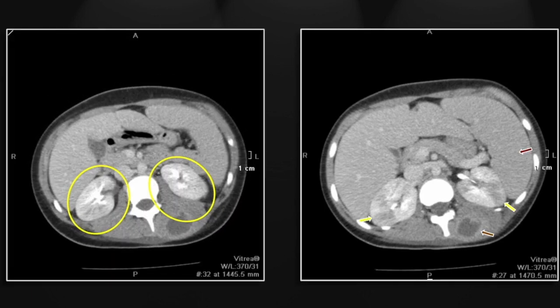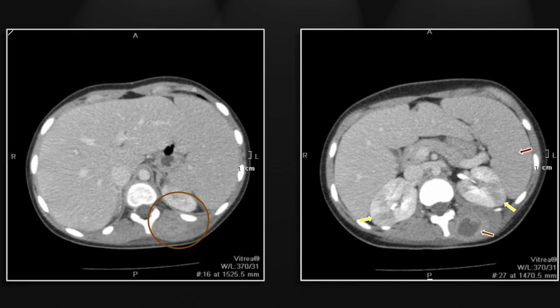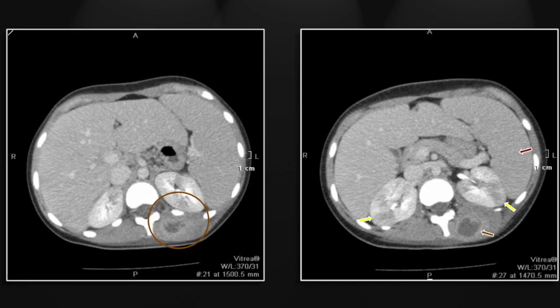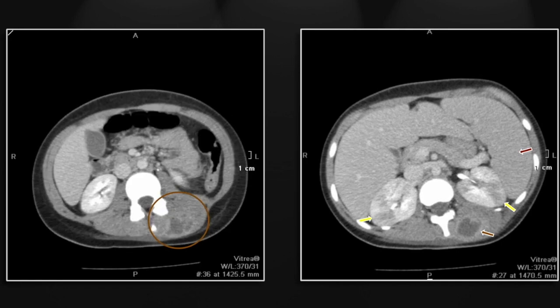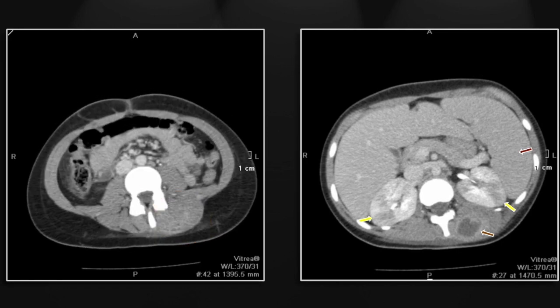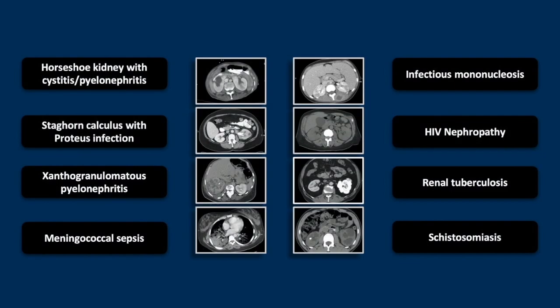So there is the viral nephritis and a soft tissue abscess. That is a case of infectious mononucleosis causing viral nephritis and, with immune suppression, a soft tissue abscess.